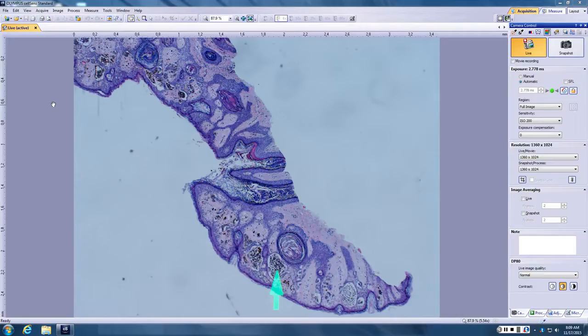But you see them in flexures too. I haven't seen a lot of pierced flexures. Earlobes certainly fit that way of remembering it. But any of the Macarena sites can have the special site nevi, and they look funny.